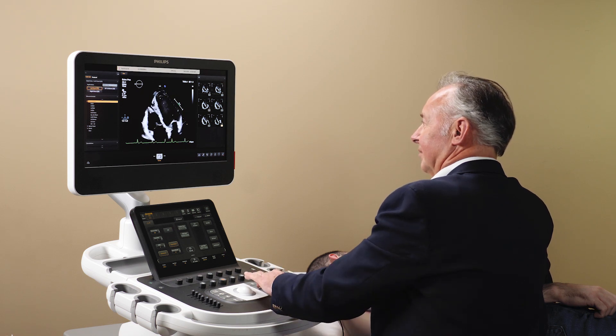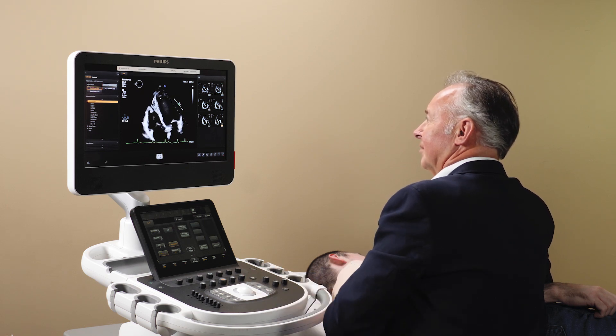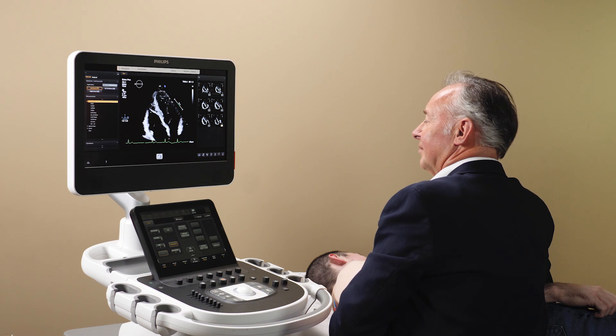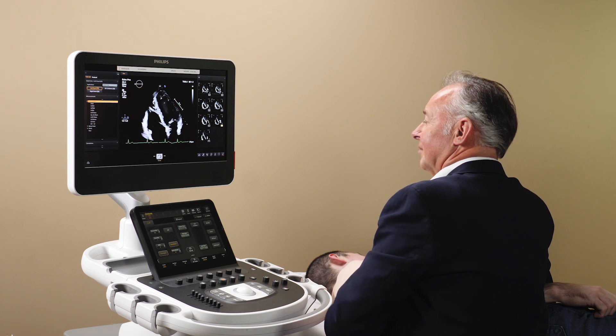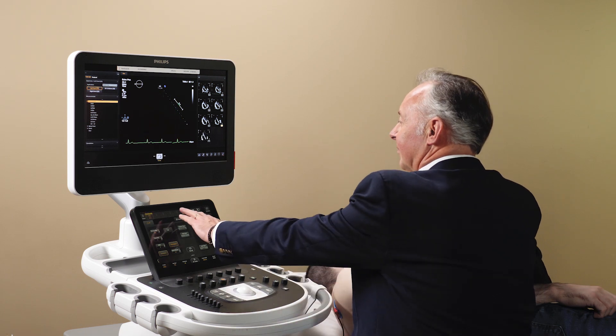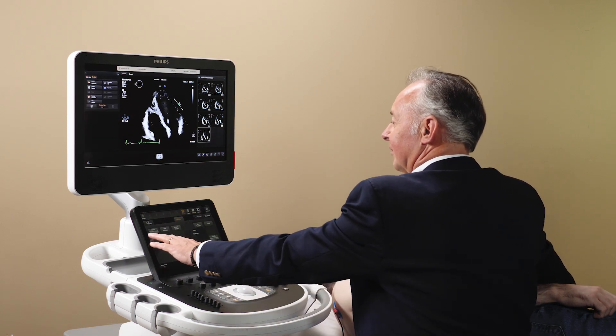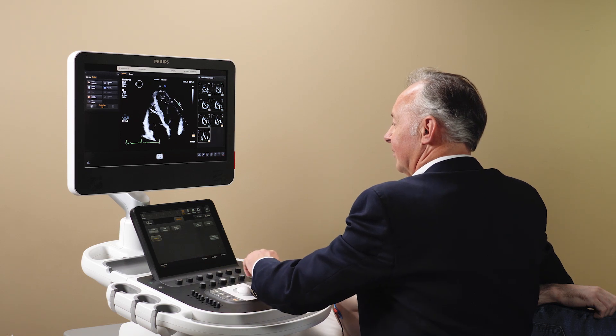Press Acquire. Press Review on the touch screen and select the acquired loop. Press Autostrain RV on the touch screen.